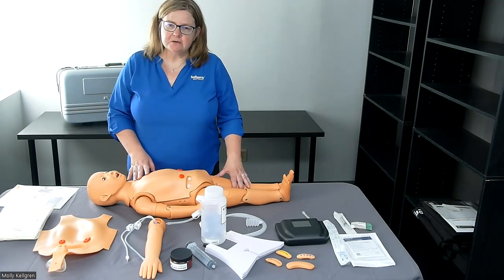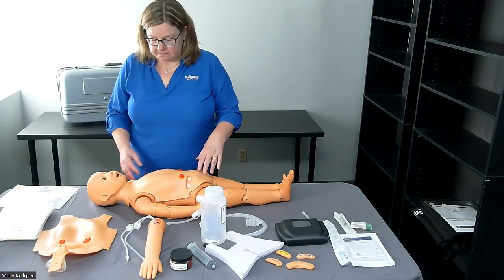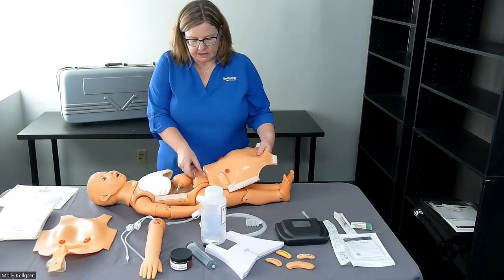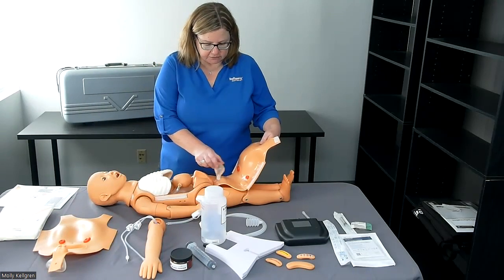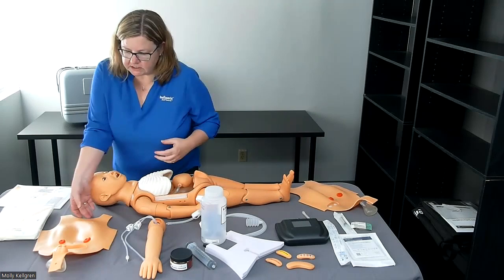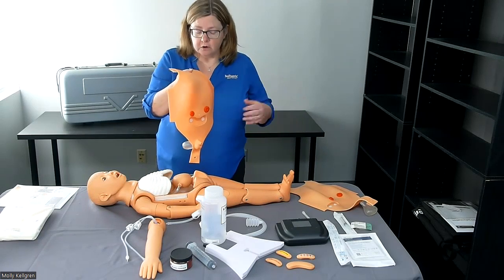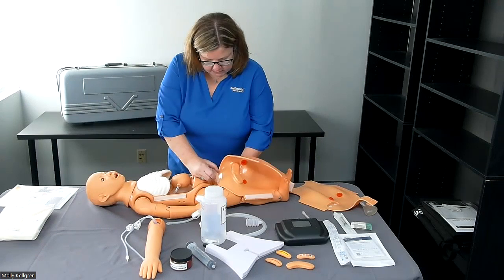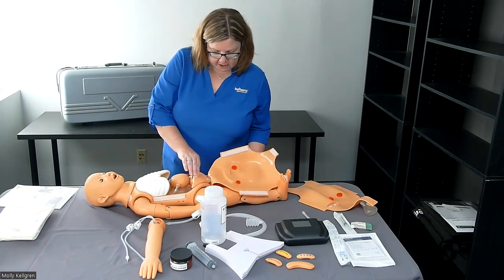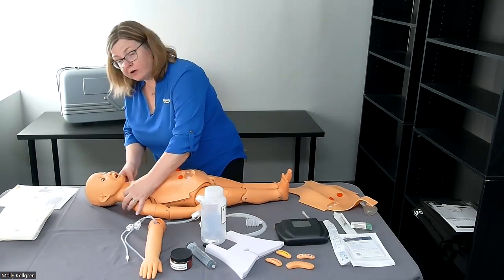Now we've got the legs attached and we're ready to talk through some of the other functionality. Let's start with changing out the genitalia — a very easy procedure. All you do is release the Velcro along the chest plate, make sure your balloon bladder is free, and pull. You can remove the female genitalia. Now we have our male genitalia, and we simply do that process in reverse: start at the bottom, press the anal piece in place, put the bladder in place, and then slide the whole chest plate up and attach the Velcro as you go.